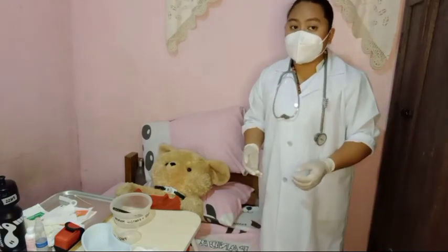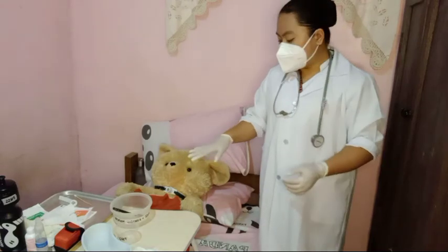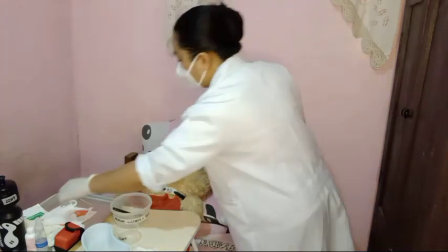Then put on the pre-prepared tracheostomy dressing.